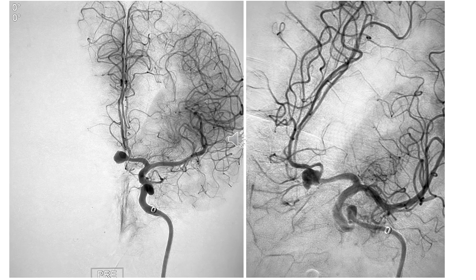This is our patient with a ruptured aneurysm. We can see this ugly nubbin over the surface of the dome of the aneurysm, and it is wide neck, involves both the A2 segments. The arteries are not that big to accommodate two balloons and one microcatheter or two microcatheters inside.